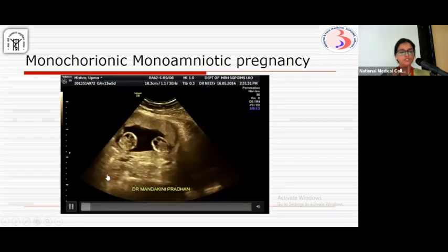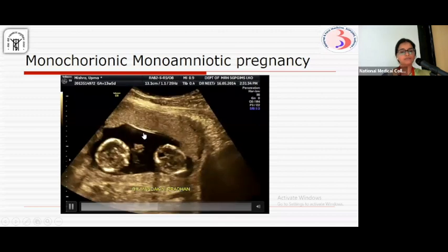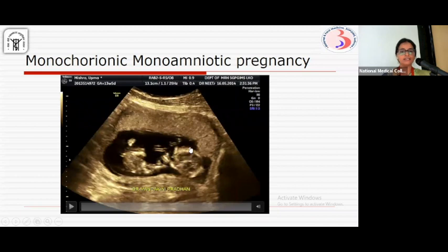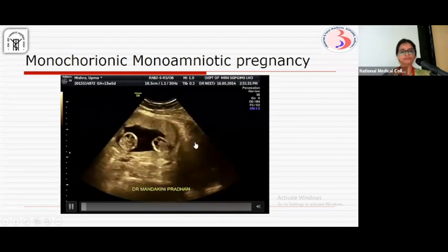This is a video showing twin gestation without any intertwin membrane. It suggests monoamniotic pregnancy.